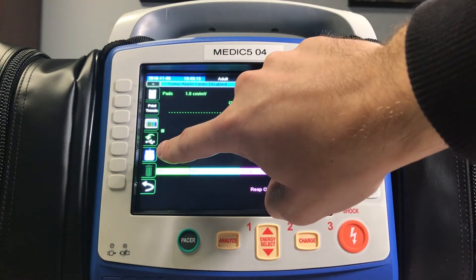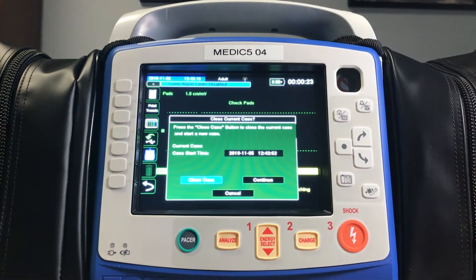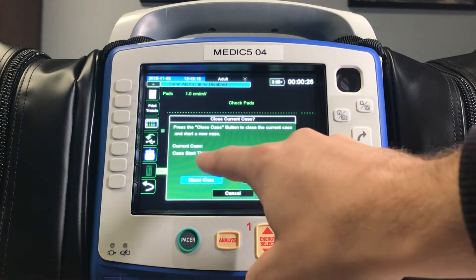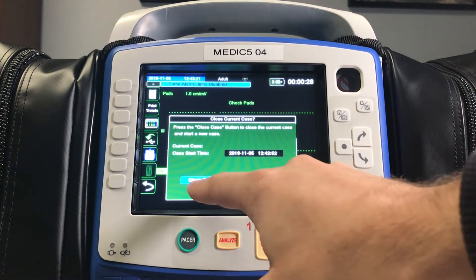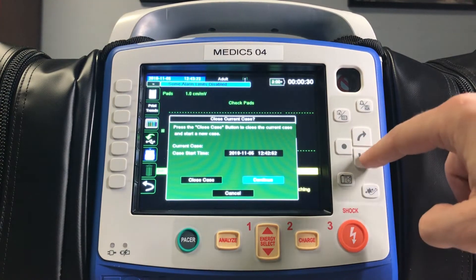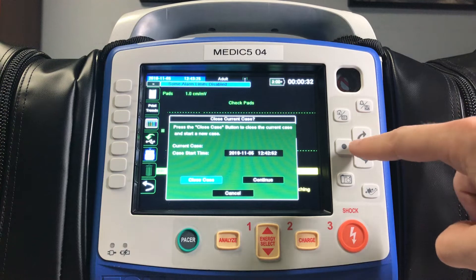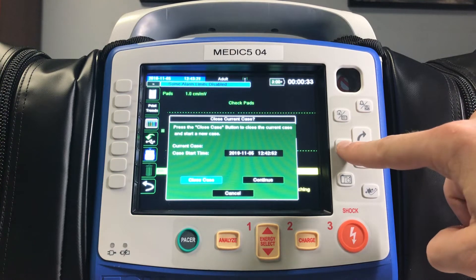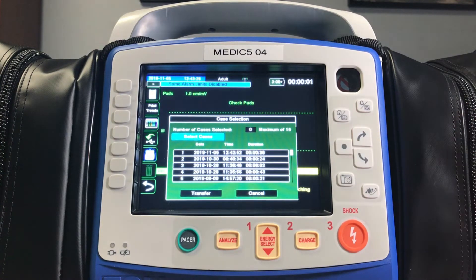Here you'll see the icon with an envelope on it, indicating the sending of the trends to a source. We're going to ensure that we close our case by using the arrows to highlight the close case option, and then press the dot button, which is our enter key on the Zoll.